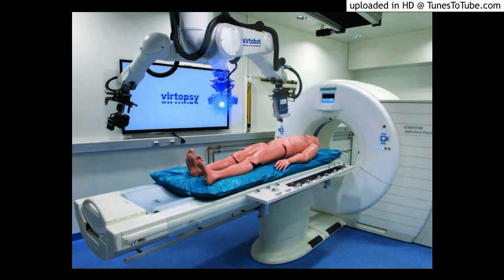The application of virtopsy in dentistry was also described by Esther Helweg et al. in a victim suffering from respiratory obstruction from a foreign body. CT and MRI were used to differentiate the obstructive structure. The information provided by virtopsy was more accurate and clear.